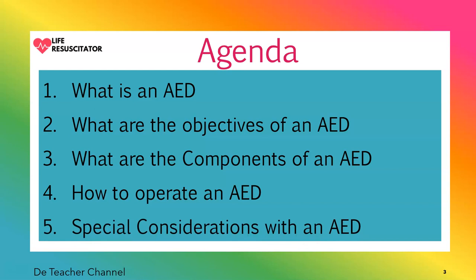So there are 5 agendas, 5 items in the menu, and we're going to go through each item one by one to review the knowledge intended through this presentation. So again, please relax, enjoy it. It's going to be an eye-opener. I promise.